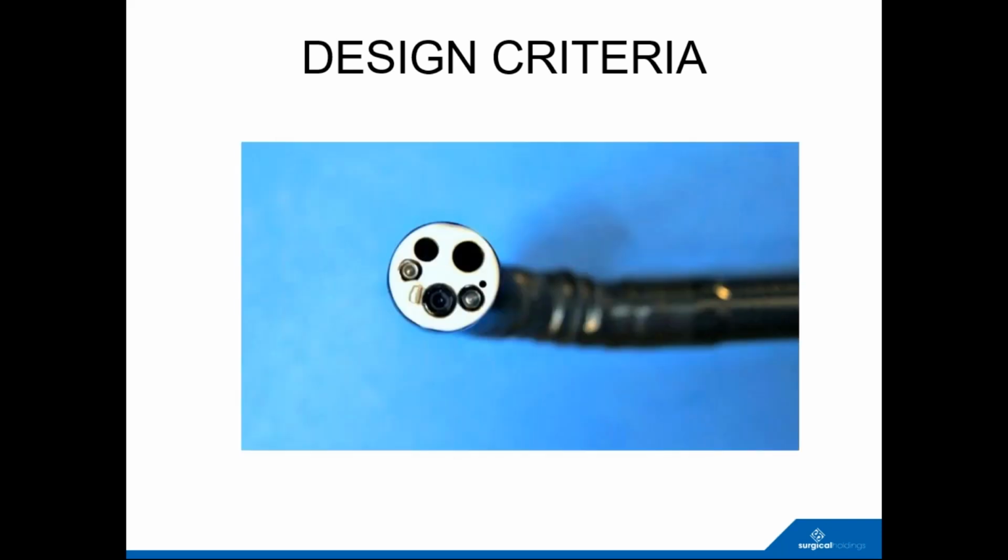To give you some actual examples that aren't diagrammatic, this is a twin channel scope. So you'll, oops, thank you very much, IT.